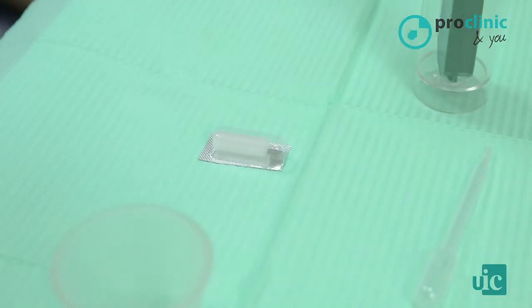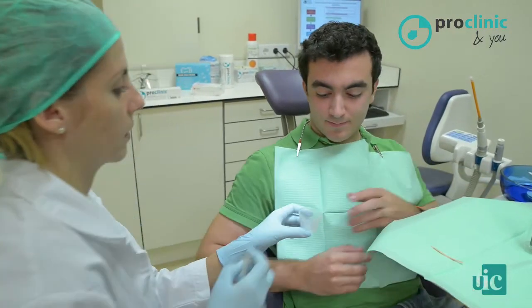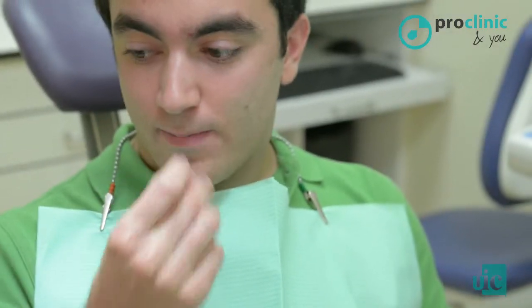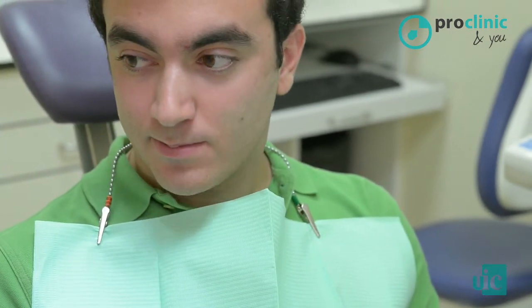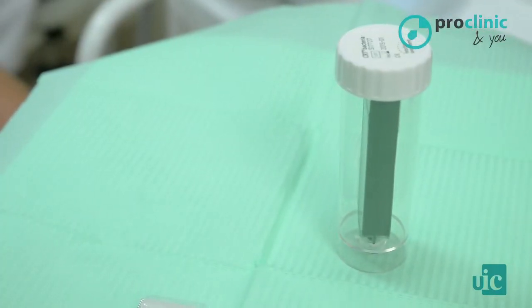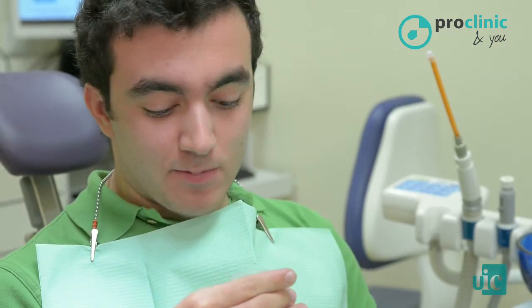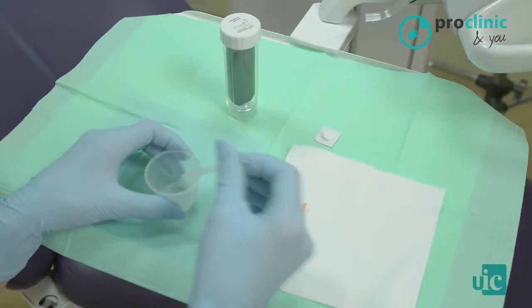To do this, we give a bar of paraffin that stimulates saliva, and we can calculate the rate of stimulated saliva per minute. Later, this saliva will be used to calculate the salivary pH. We have a test strip, and with this, we calculate the pH of the saliva. If the patient has an acidic saliva, this would favour the formation of dental caries, or if he has a bigger basic pH, which would be a protective factor.